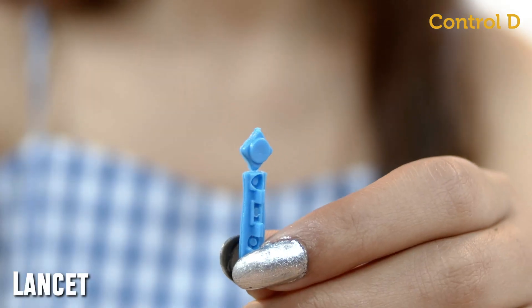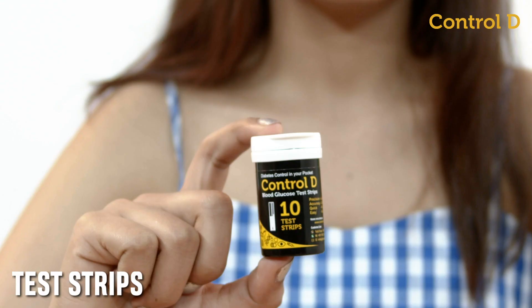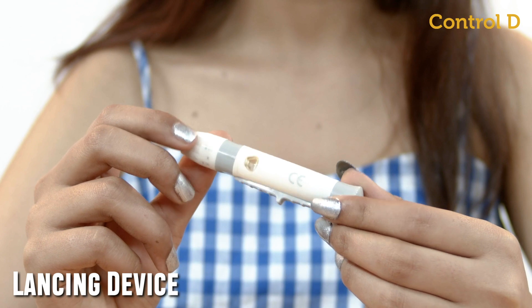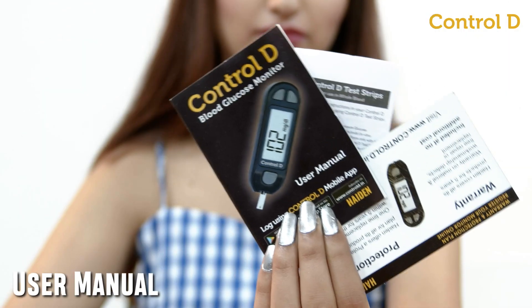Control D Glucometer Kit consists of lancets, test strips, battery, lancing device, glucometer, and user manual.